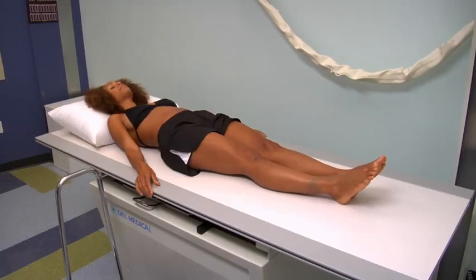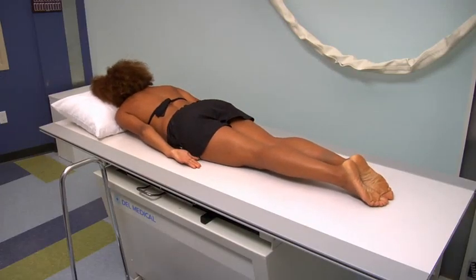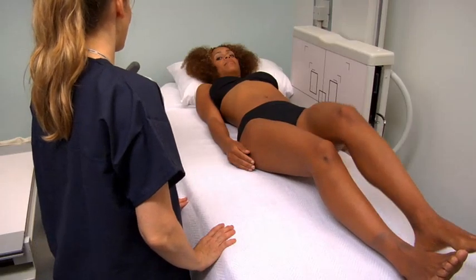There are several positions that are commonly used for radiographic imaging: supine, where the patient lies on their back; prone, where the patient lies face down with their arms at their side; and erect, which is an upright position where the patient may be standing or sitting. Specific body positions also may be used.